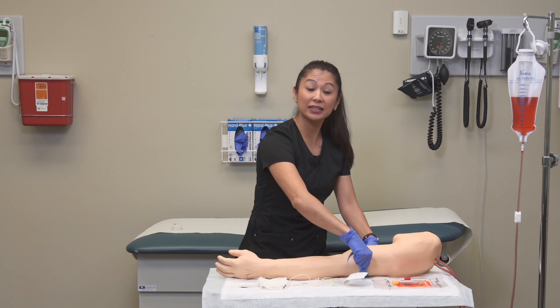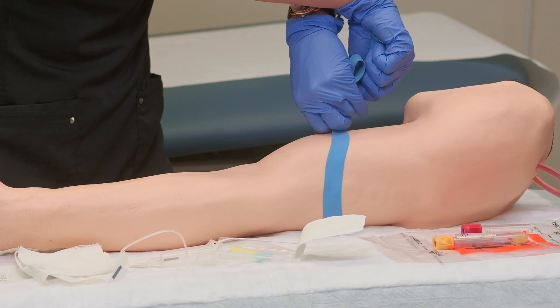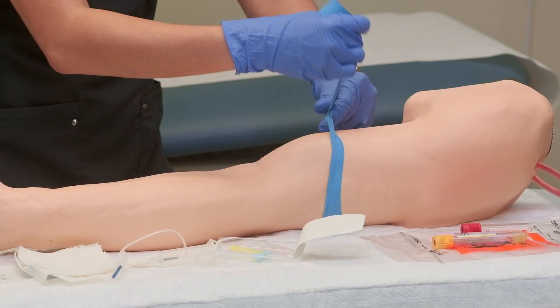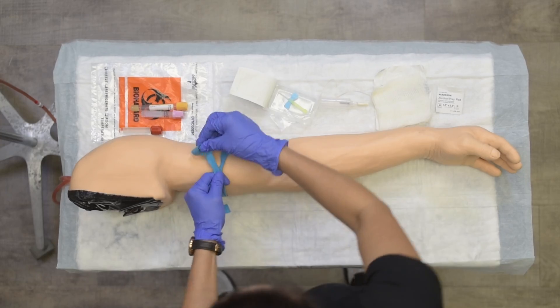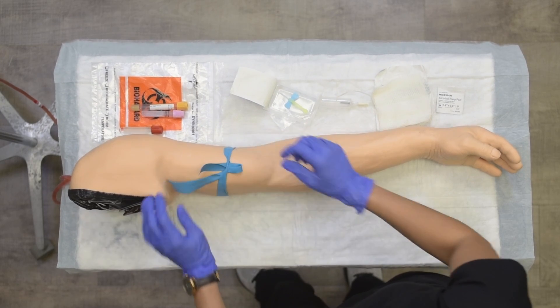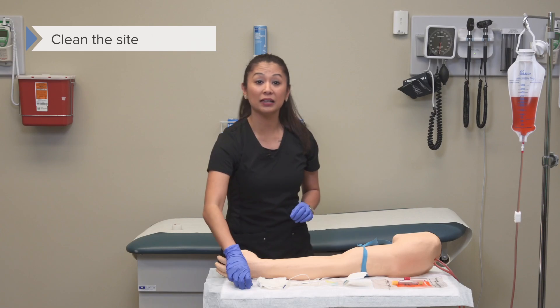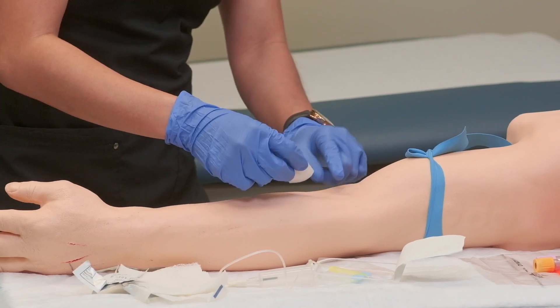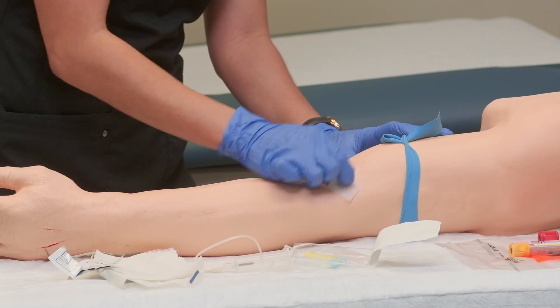I'll grab the sides for a little more tension, cross my hands, and gather this in an X-like fashion. Then I take the tail and poke it through without going all the way through and leave it there. Now with the tourniquet in place, I can clean my site using an alcohol pad, making sure to thoroughly clean the area.